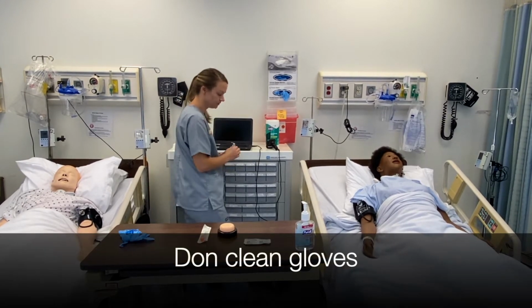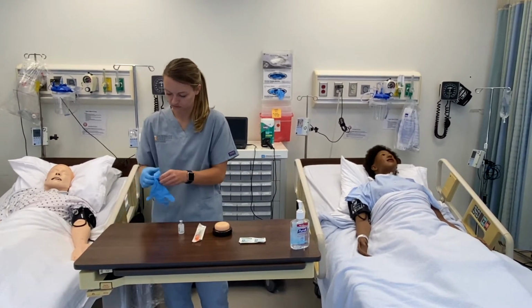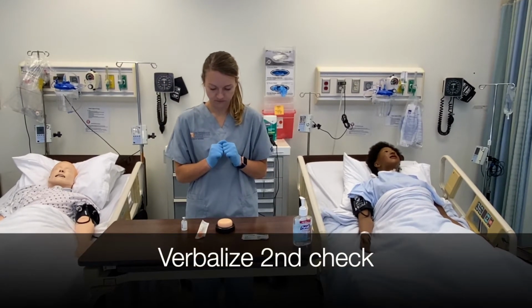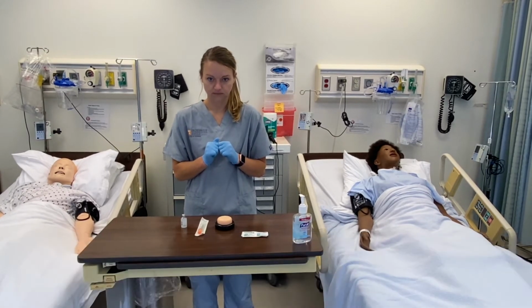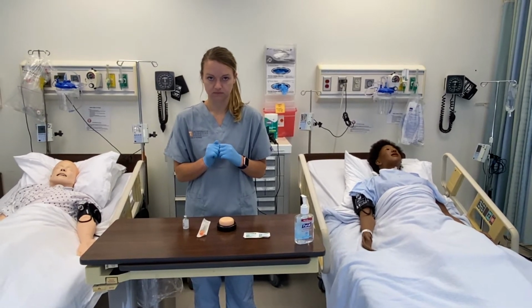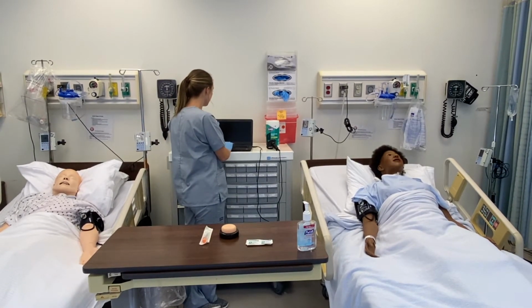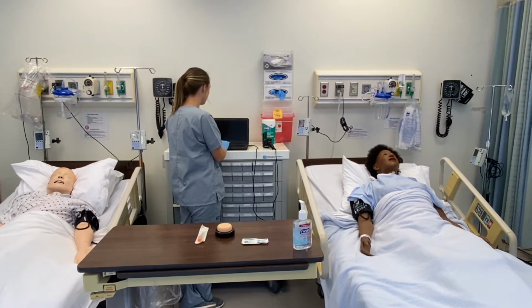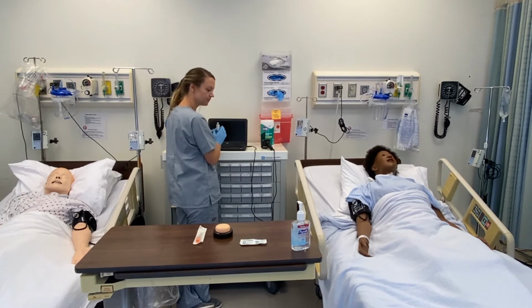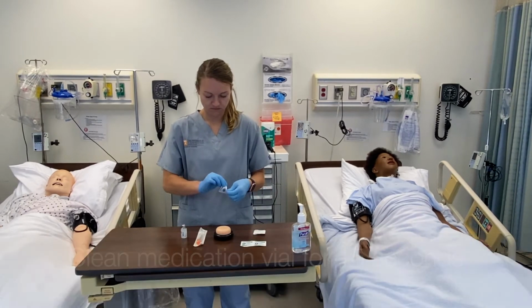Don clean gloves. Verbalize second check, comparing med label to EMR, including medication label, calculated dosage, correct route and time, and verify with a second RN. So I'm going to give NPH, which I have an order for. I'm going to give 10 units, which is 0.1 ml. I'm going to give it SubQ now, and I'm going to verify this with another RN. Clean off the top of medication vial with alcohol swab, rubbing top of vial for at least 15 seconds.